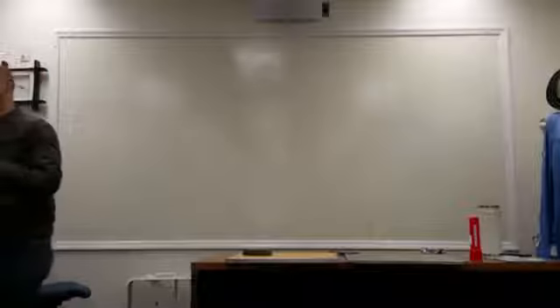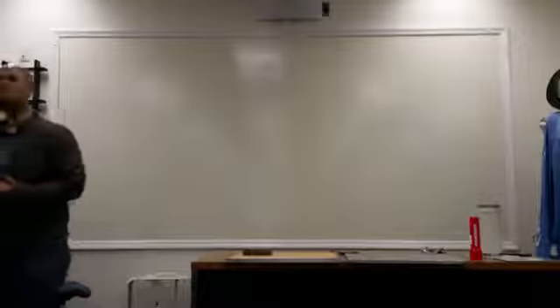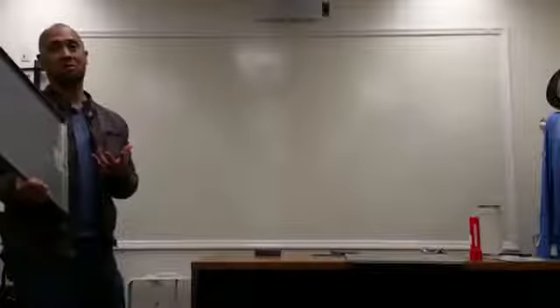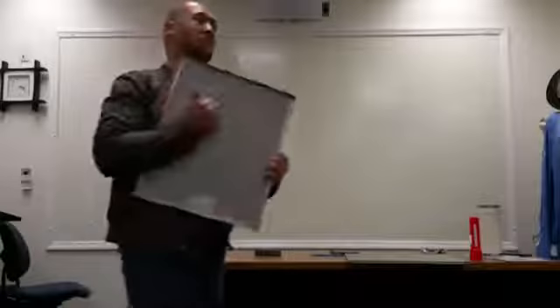Is the grid part of the Bucky tray, or is that something else? Okay, so the question is, is this part of the Bucky tray. What I'm going to do is introduce to you two ways in which the grid is employed. One would be portably outside of the department, and the other one is actually built into the construction of the table, okay? But for intents and purposes, so you guys have a better understanding, I'm going to utilize the portable one for demonstration.